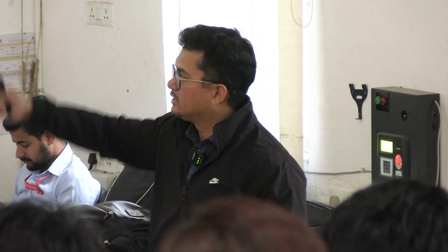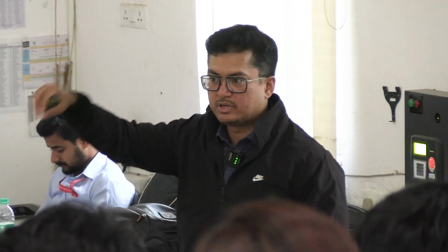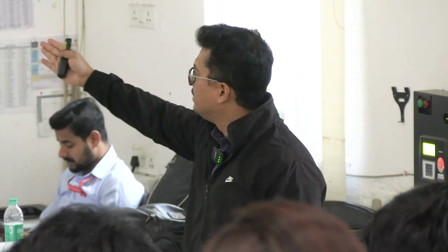তাহলে অ্যান্টিবডিটার সাথে আমি এনজাইম অ্যাড করেছি, তারপরে একটা কালার দিয়েছি। সো যখনই অ্যান্টিজেন অ্যান্টিবডি বাইন্ডিং হবে, the enzyme will go off and activate the chromogenic substance and we can see the color in the slide. So that is exactly like immunofluorescence, like immunoelectron microscopy, but with a different set of enzymes. So you have the HRP enzyme. Okay.